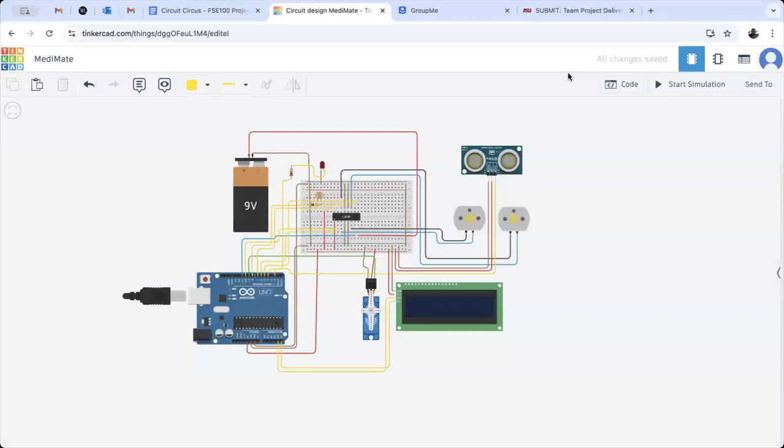Hello, everyone. My name is Chris Brown, and I'd like to show the Tinkercad circuit for the MediMate robot.